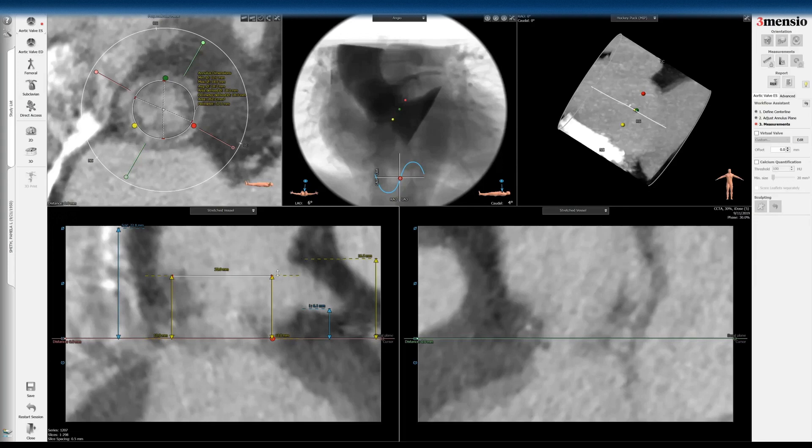But you can see the valve sits below the sinotubular junction. So it's really not even necessary to look at the risk of outflow obstruction here — it's going to be low risk. But what you can do is using this view, you can on fluoroscopy do a cranial view to line up the base of the surgical valve to take out the parallax and then do a semi-selective root shot to confirm that.